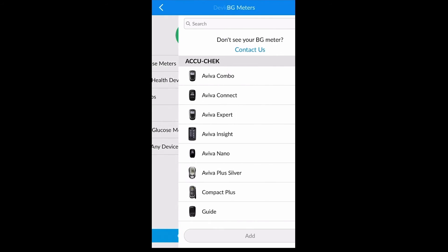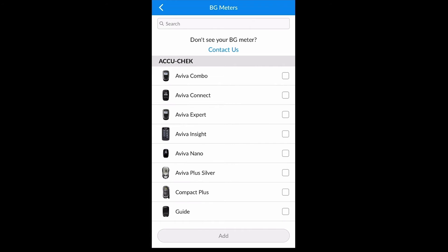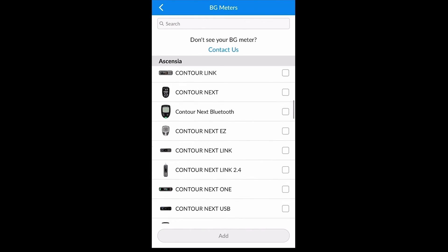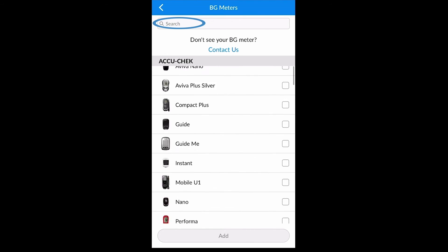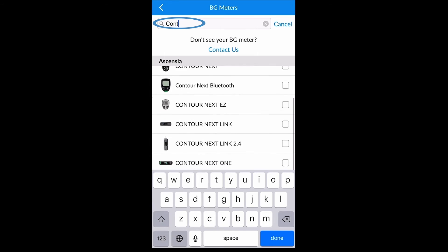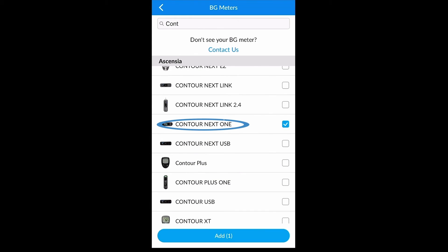From this screen you are able to scroll through compatible devices to select the device you would like to upload. Alternatively, you can use the search function at the top of the screen to search for the device you would like to upload. Once you have found that device, select it and click Add.